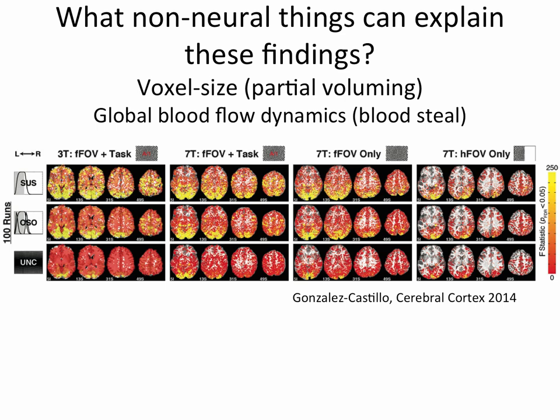We also did the exact same thing in a second subject. They did it with just the checkerboard without the attention task. So we don't know if their mind's wandering or not, but it also means that we don't have the secondary task with button pressing and letter number discrimination going on. And we see pretty much the same result. We do the same thing, showing the same checkerboard, no task, on only a hemifield the whole time.